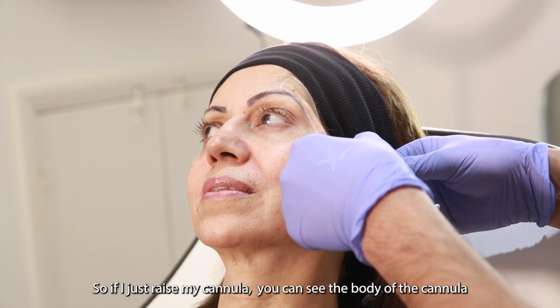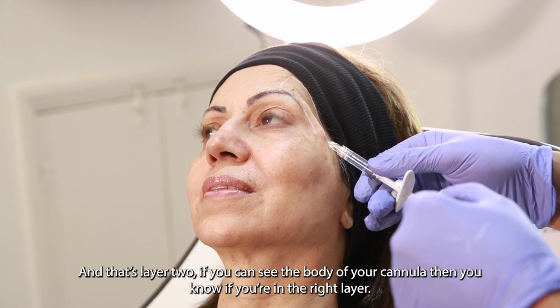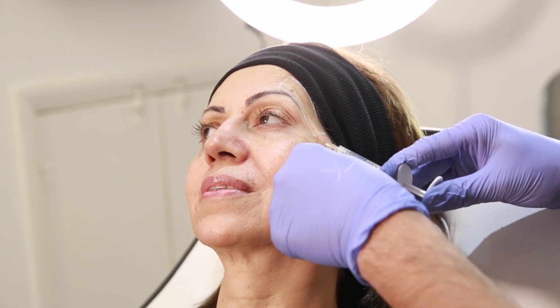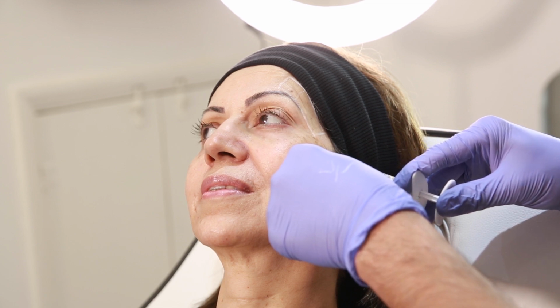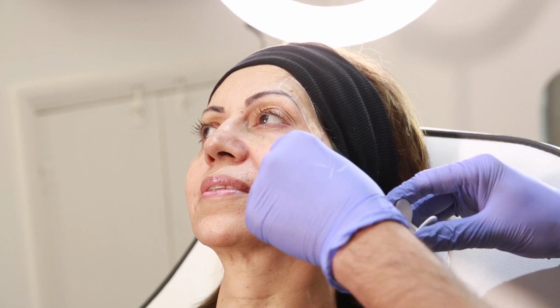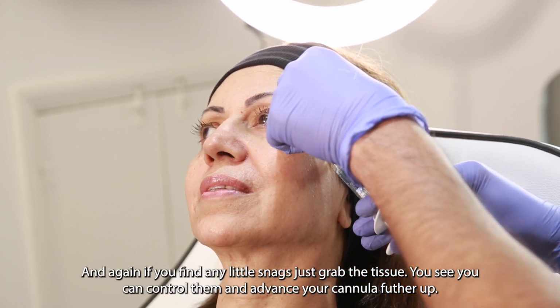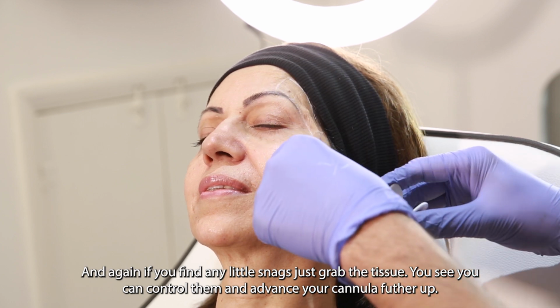So if I just raise my cannula, you can see the body of the cannula, and that's layer 2. If you can see the body of your cannula, then you know you're in the right layer. Nice slow linear threads coming in. Again, if you find any little snags, just grab the tissues so you can control them and advance your cannula further up.